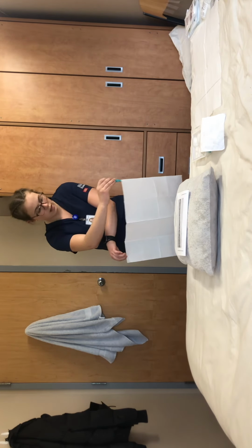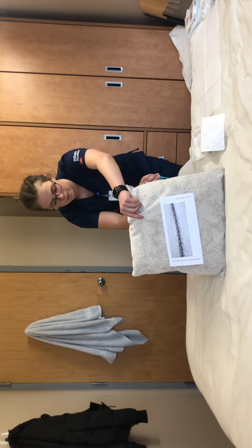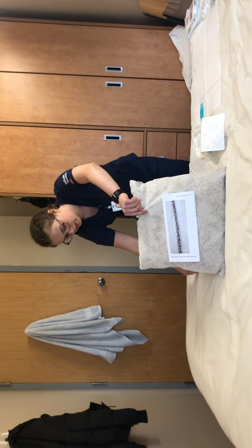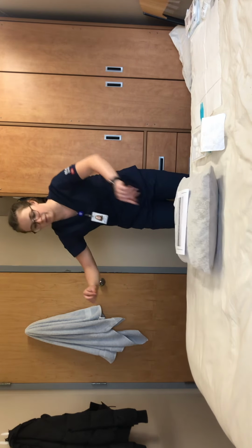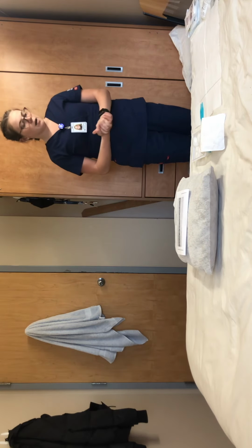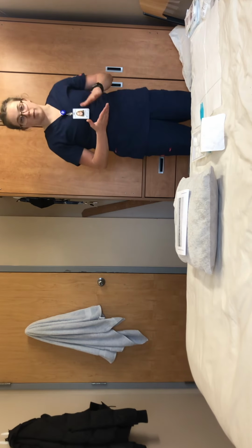So just place that dressing downwards, lift the patient up, and then I'll place that in the sterile field and adjust with my fingers. Place the patient back over top of the dressing. Now that I have my sterile field all set up, I'm going to be opening up all of my packages.